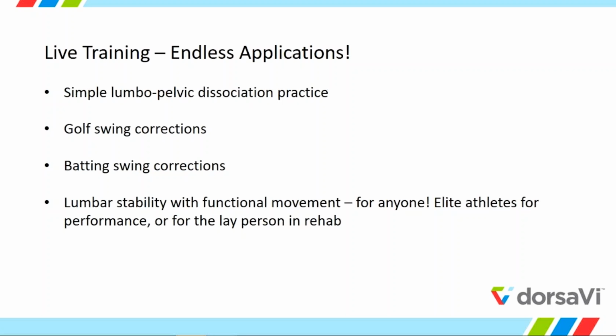So Joanna, tell us a little bit about how you used it with that. Yeah, we have one clinic that treats a lot of baseball players, and a hitting coach came in and wanted to see if we could use it for that. I'm not a baseball expert, obviously, but what he said the kids' issue was that they would get into the hitting stance position the first time, then they'd swing, and they'd have the inability to get back into that same position again. I liken it to a tennis serve where you've really got to weight that back foot and sit your butt down and get back there.